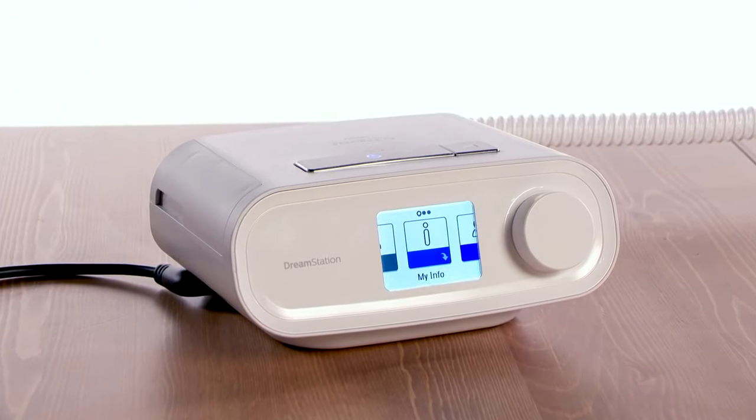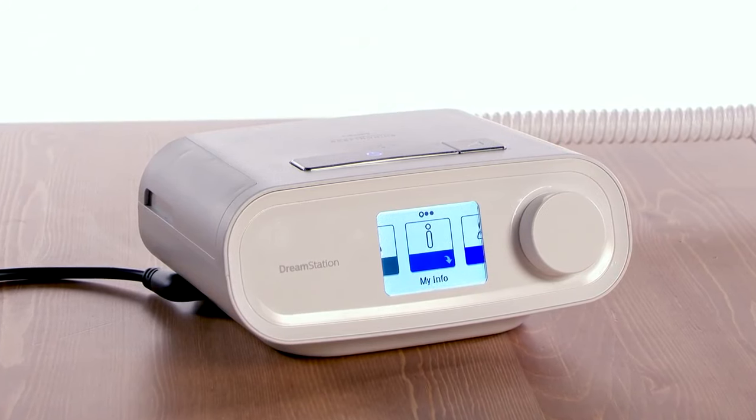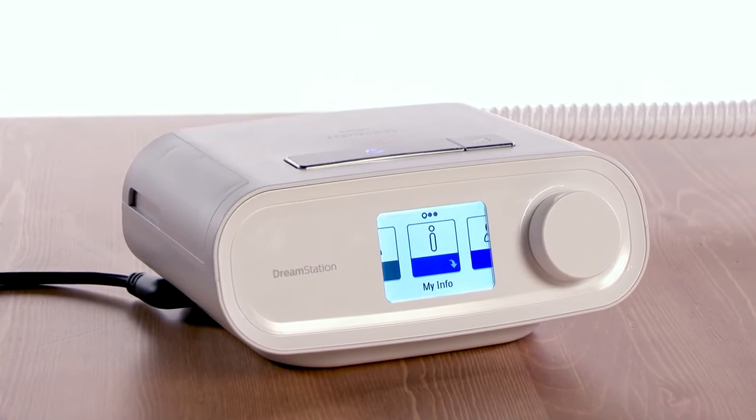Your DreamStation sleep therapy system is capable of transmitting therapy data to your care team through a Wi-Fi accessory modem.